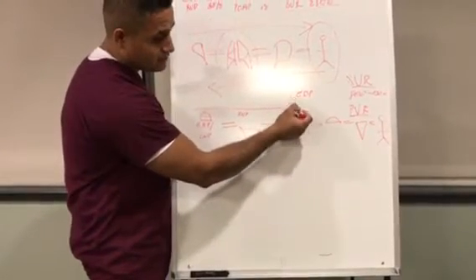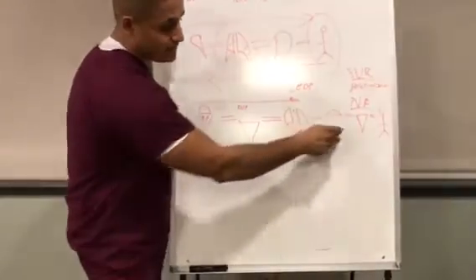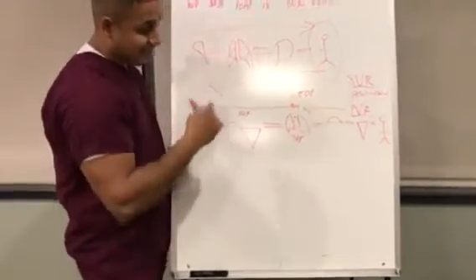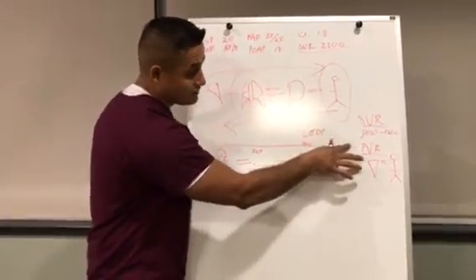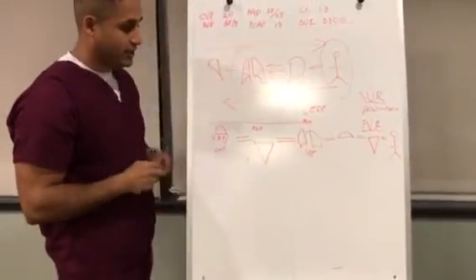And the tip of the catheter is open to air and it has a little bubble. That bubble senses the pressure that's being exerted this way, because remember, pressure moves this way. This is how we can get the pressure on the left side, okay? But the catheter never goes to the left side. It stops in the left branch of the pulmonary artery.